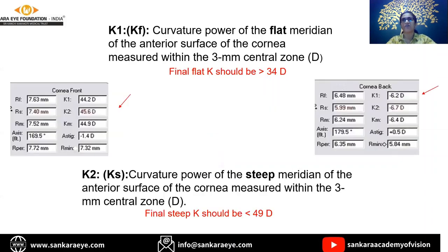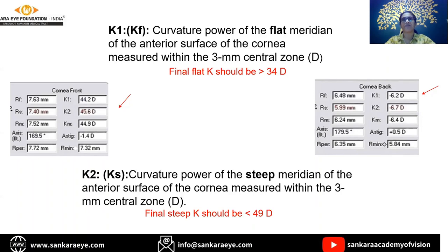Once quality and asphericity are assessed, we look at K values. K flat, also called K1, and K steep, called K2, represent the curvature power of the flat and steep meridians of the central 3 mm zone of the cornea. These are essential when planning refractive surgery. The rule is: post-refractive surgery, whether myopic or hypermetropic ablation, the corneal K should not become flatter than 34 or steeper than 49. Either extreme leads to an unusual cornea with high optical aberrations and poor quality of vision. The axis shown represents topographic astigmatism, always to be compared with manifest astigmatism from refraction.